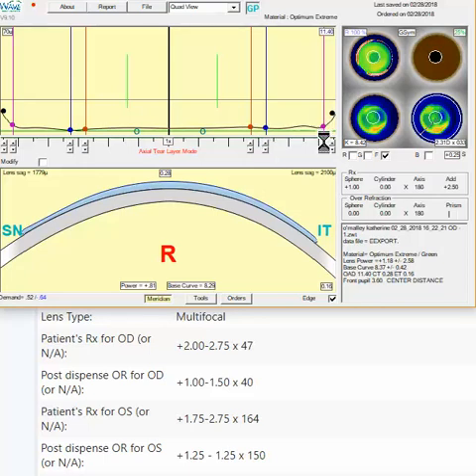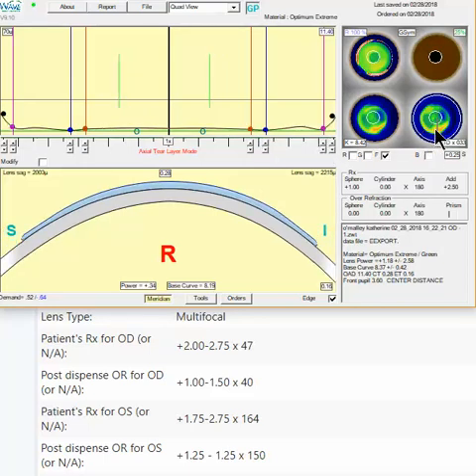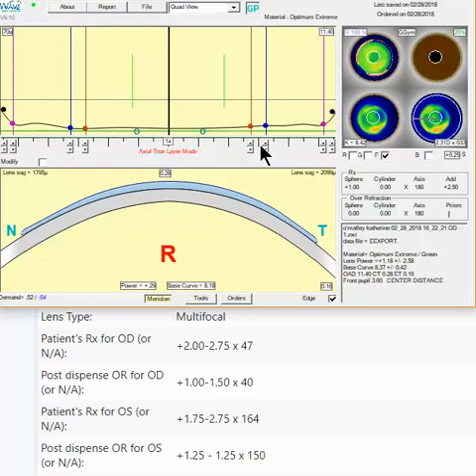If you want to adjust the edge a little bit, you can go a little bit further over here if you want. Bring this one down a little bit also. And that way you can adjust that quadrant. Remember, in freeform, if you're adjusting right here, it is not going to adjust the other side. It's only going to adjust that one radial that you're looking at. Same concept goes for the left eye when you're making those adjustments.